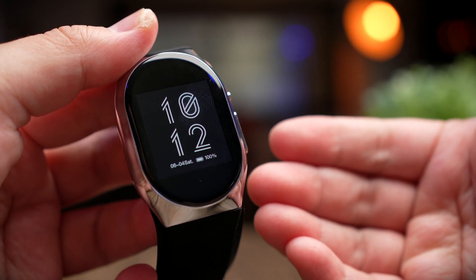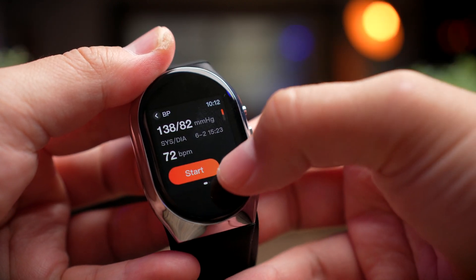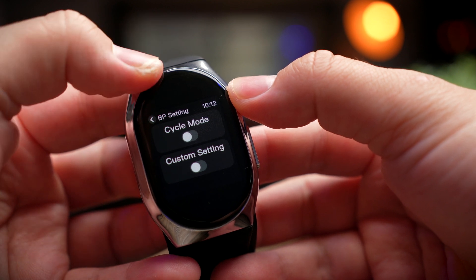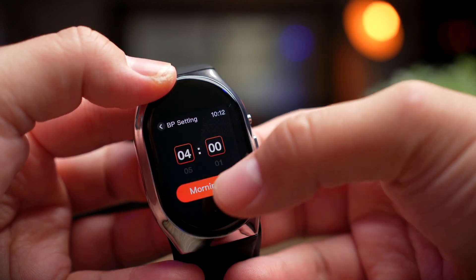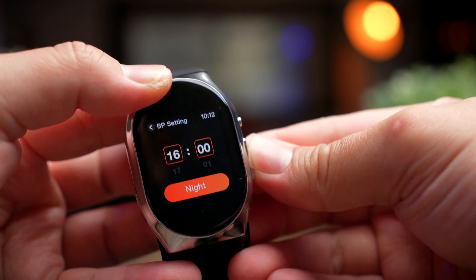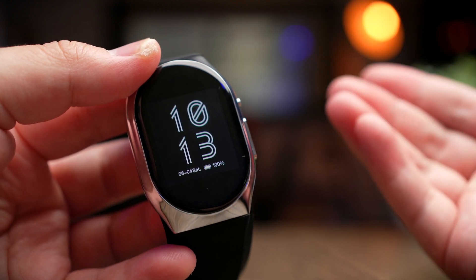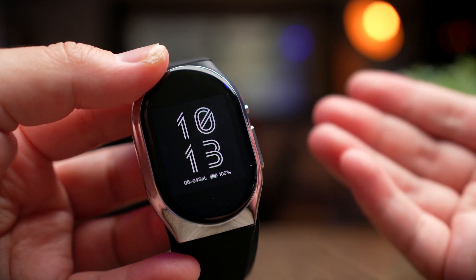There is also a cycle test function in the BP monitoring. Under BP you'll find a clock icon — clicking it shows cycle mode and custom settings. I thought the cycle test would fire automatically at set times for morning, noon, and night, but what it actually does is send you a notification so you can start it manually. The reason is that you might be walking or exercising, which would render the test inaccurate. Having that notification is actually quite smart.